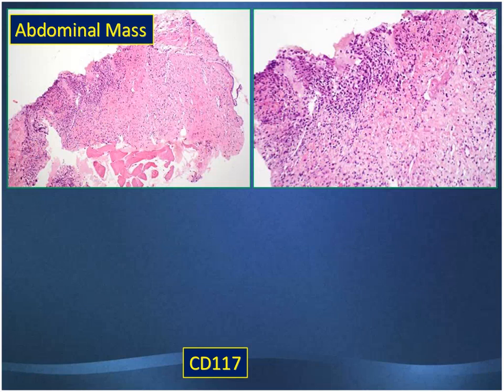Now, I share with you this particular case, which was very difficult. There's a core small biopsy of an abdominal mass in a young individual. I believe it was a male, and it shows some connective tissue, what appears to be inflammatory cells here and there.